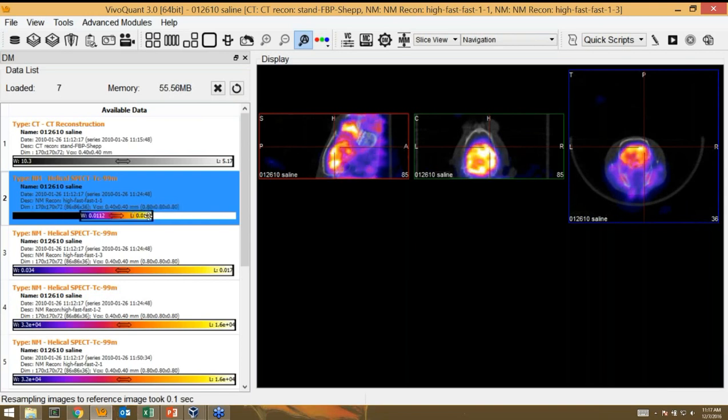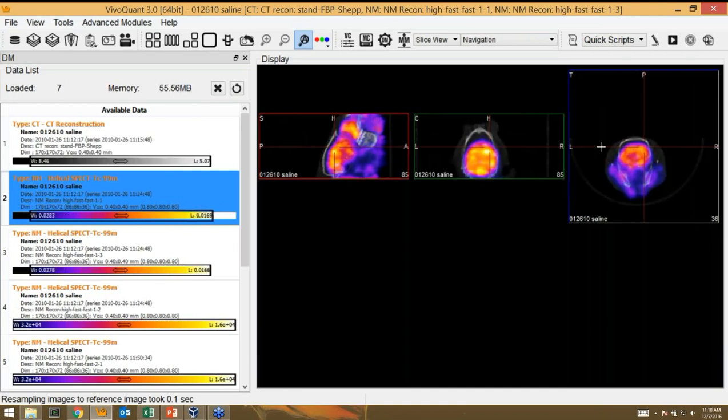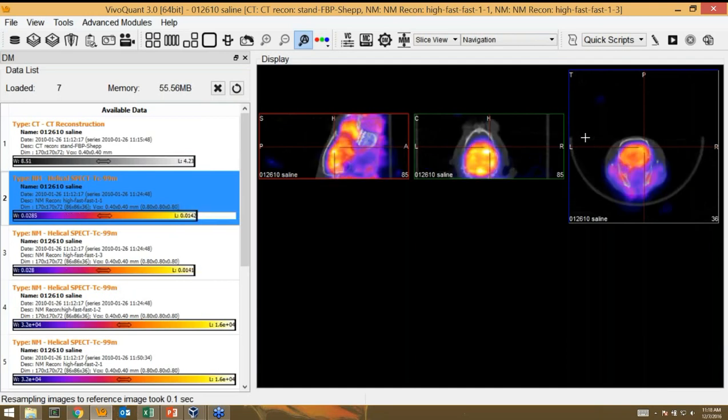You can still use essentially the same tool in terms of just adjusting one end of this as you would with the min-max. If you hold Shift and click, the ends freeze and drag similarly to our min-max. And here also we have the right-click options. If I right-click and pull down, my window width will grow and shrink. Left and right, I'll be sliding that level. So just trying here to make it a little bit easier to interact with your data in a way that's as easy and seamless as possible as you're moving through the software.